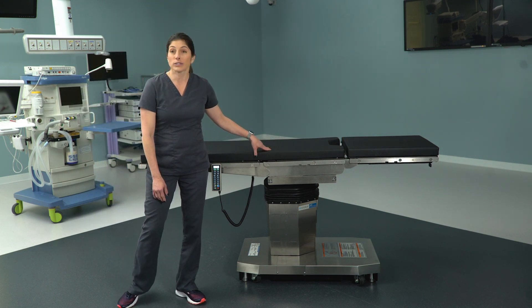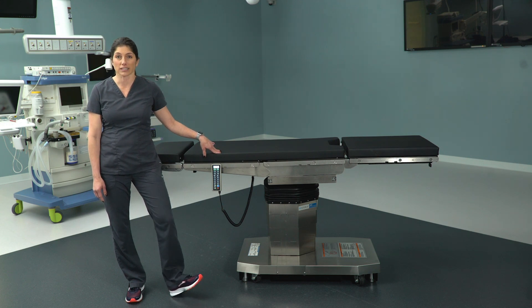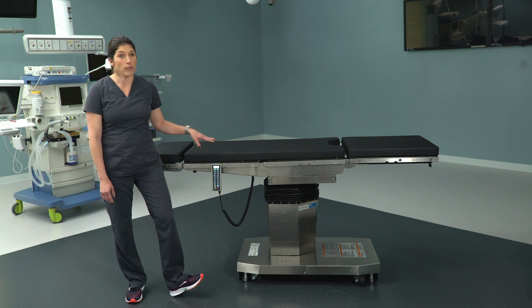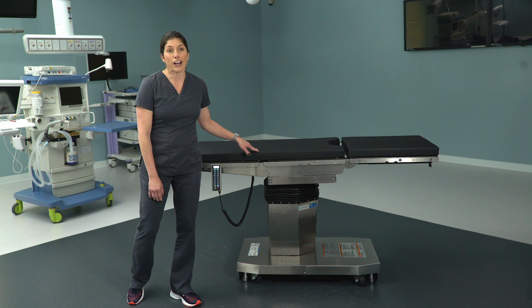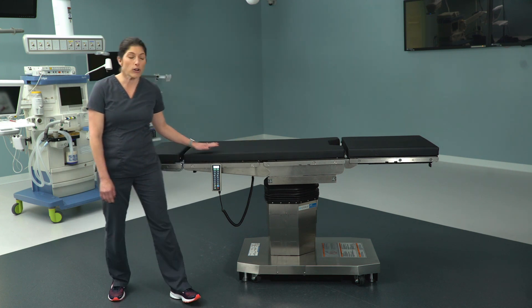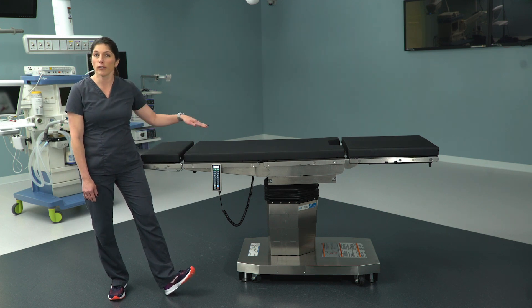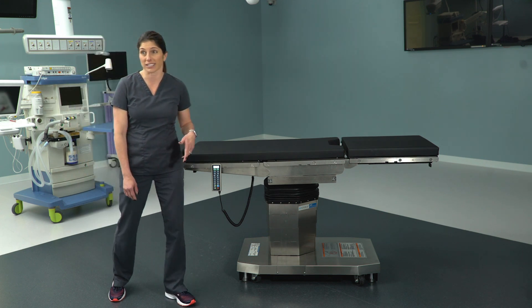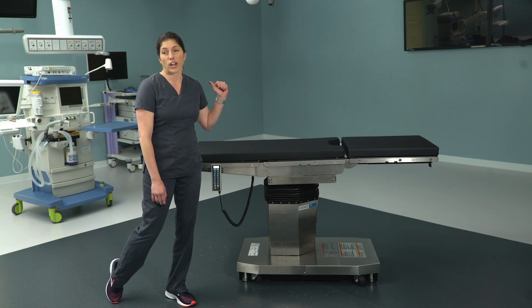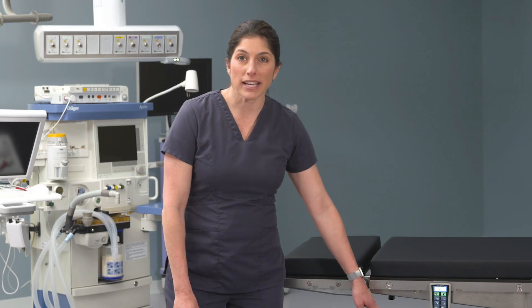That was important on the 3085 so that you knew how to set up your patient for imaging access. You'll find — and probably be happy to hear — that now you don't have to have the forethought prior to putting the patient on the bed, because now you have the ability to slide the tabletop to the head or to the foot depending upon where you need imaging access. You no longer have to think in advance whether to put the patient in reverse orientation.